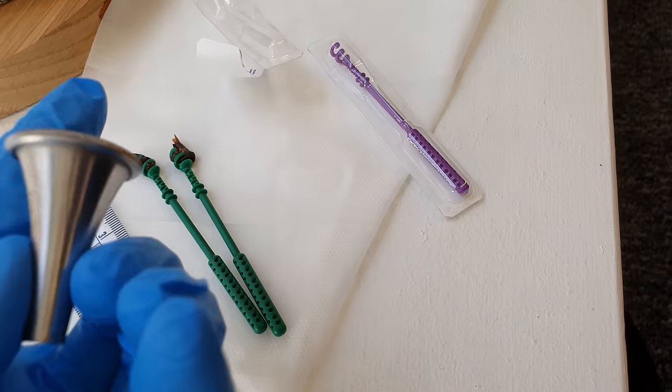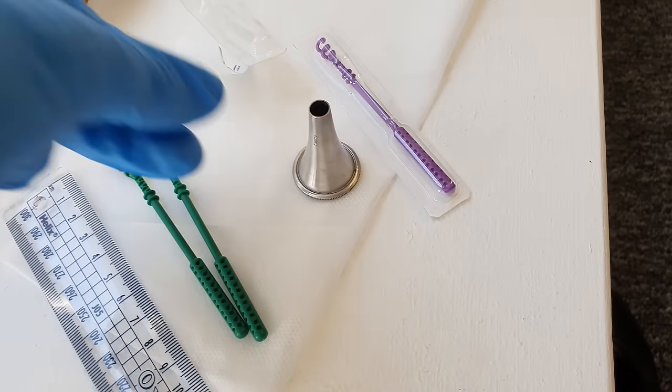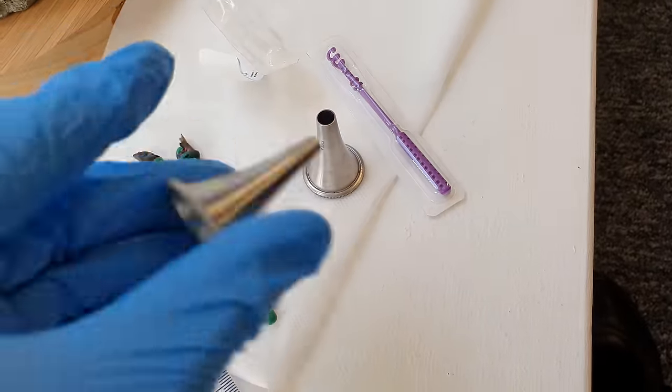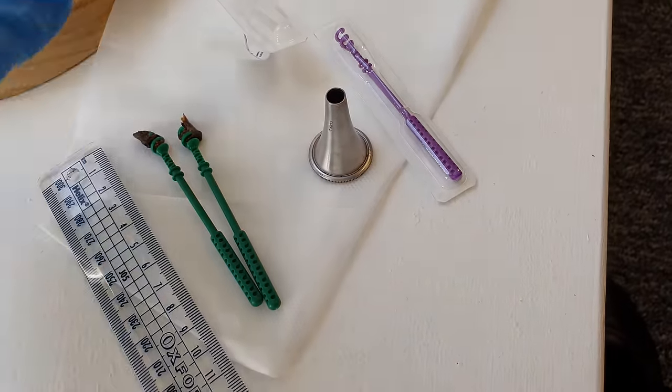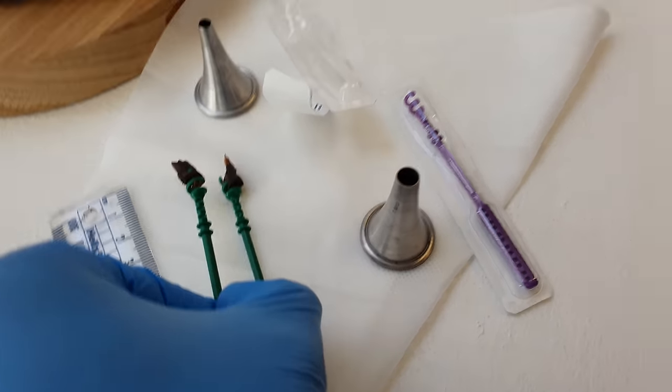Those are the two larges — the two green ones — and there's the six mil speculum. I usually have a medium on standby, but I didn't need it in this case. And these are the plugs we extracted — the same plug really, just in two segments.